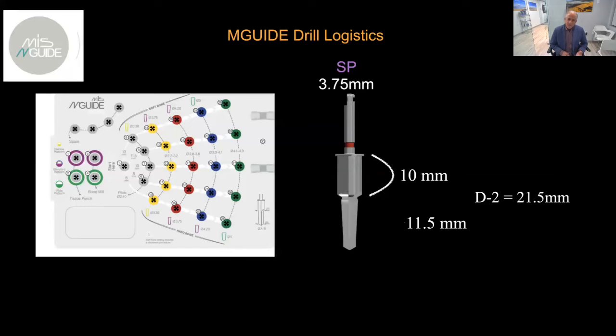So it's always going to be 10, and then for a 10 millimeter implant, the osteotomy or the cutting flutes are going to be 10 millimeters, 11.5, and 13 as you go up for an 11.5 implant or a 13. So it's kind of a neat system because you can change within the day of surgery. If you want to place a longer implant, you can do that and still use the same guide that you have.